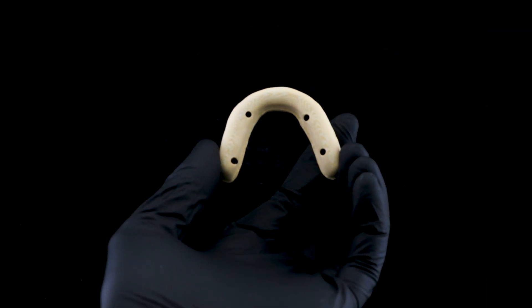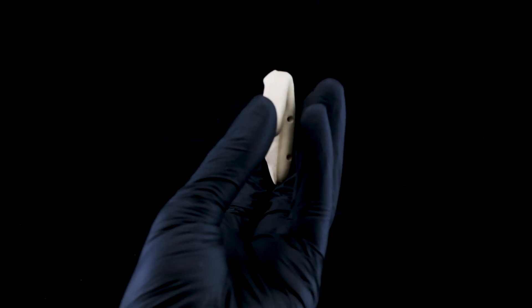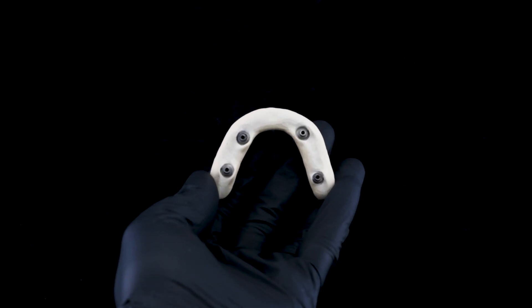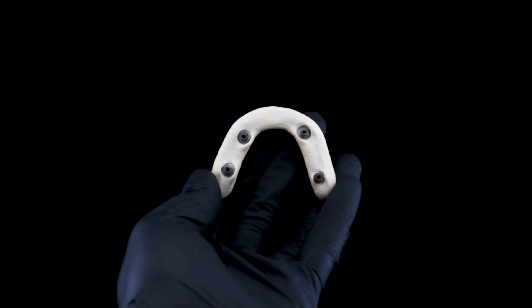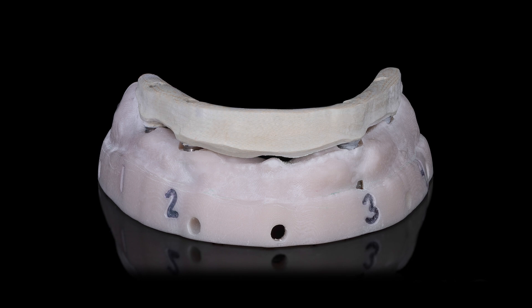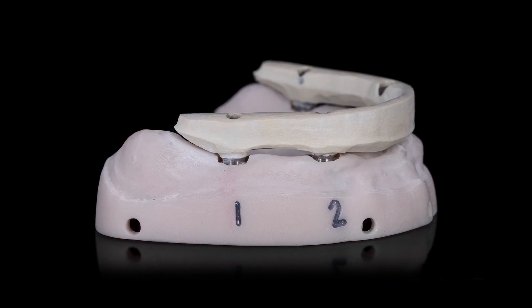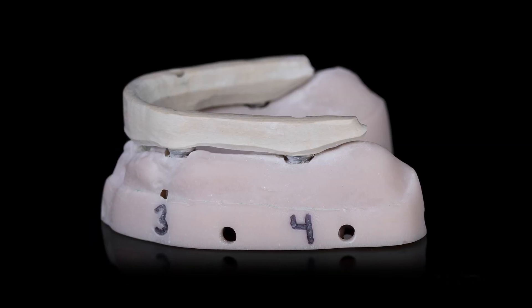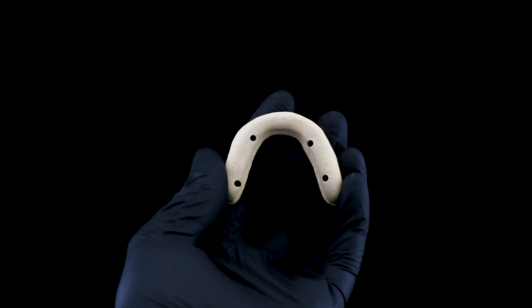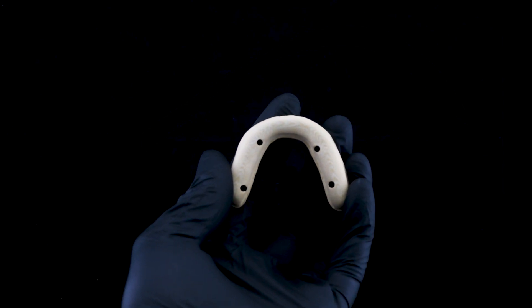Today we're going to do a little stress test on our powerful Trilor material. You might be asking yourself, what's Trilor? Well, it's a high performance technopolymer matrix with multi-directional glass fiber reinforcement for permanent aesthetic restorations on implants. In other words, it's strong. Really, really strong.